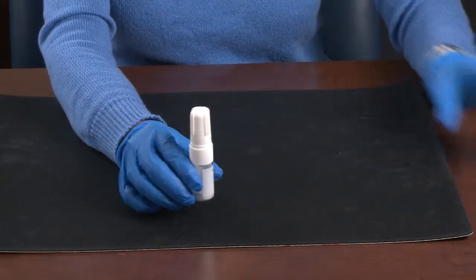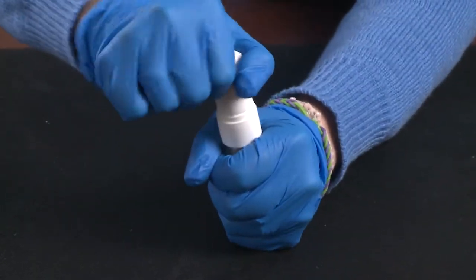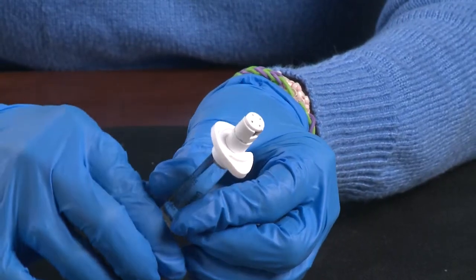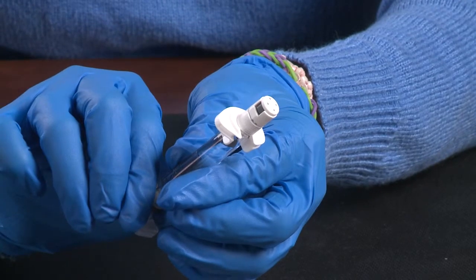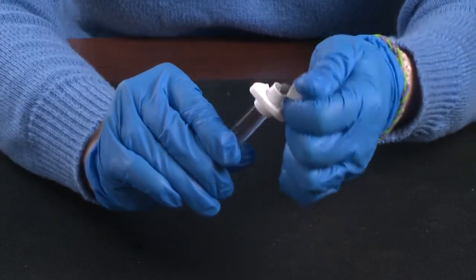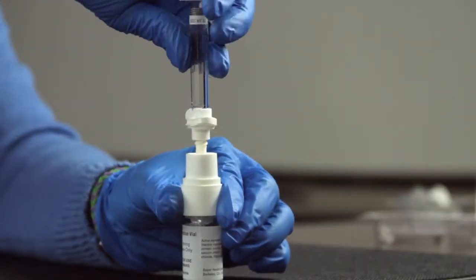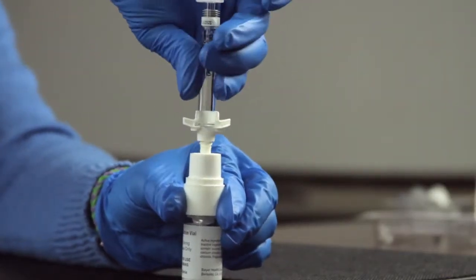Set up on a clean, flat surface. Remove the vial cap by moving it from side to side while lifting up. Make sure that the tip cap has not been tampered with on the syringe, then carefully separate it from the syringe. Connect the pre-filled syringe to the top of the vial, but don't over-tighten.